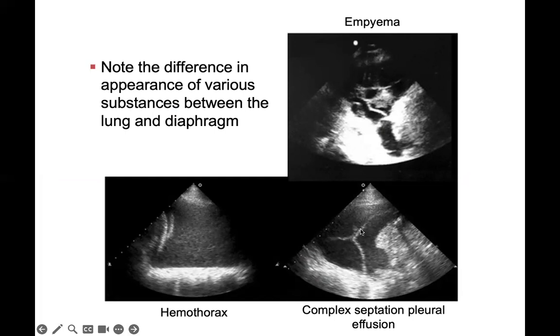So here again, we see these lines or adhesions. And this one is actually a hemothorax because it's all isoechoic rather than black. Sometimes your pleural effusion can look isoechoic if it's overgained. So just make sure that the gain is decreased if you think it starts to look a little grayish.